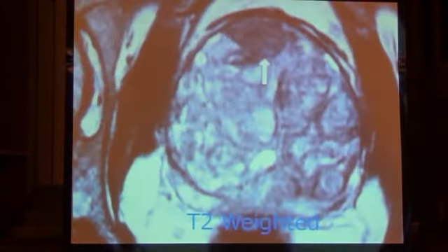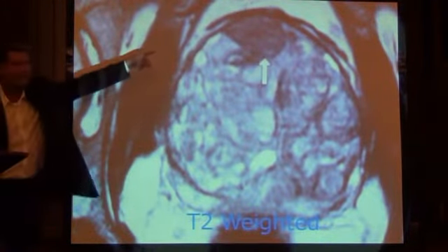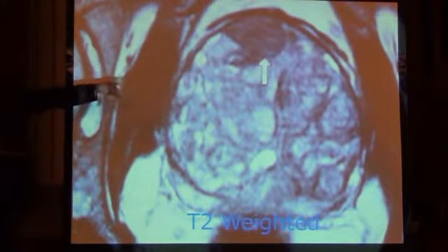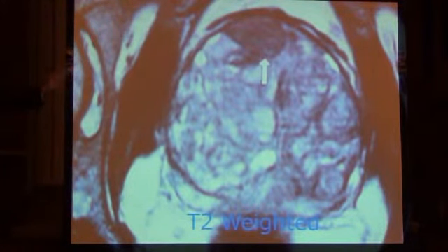Go ahead. So what they're looking for, this is T2 weighted imaging. T2 weighted images show highly suspicious tissue that's dark. And you can all see where that arrow is right there. This is the prostate gland itself. I'll show you in a minute what an ultrasound looks like. This is the prostate gland, so you can clearly see the anatomy of the prostate gland. You can see the zones, you can see exactly where it is, see what's going on. See that dark spot up there?